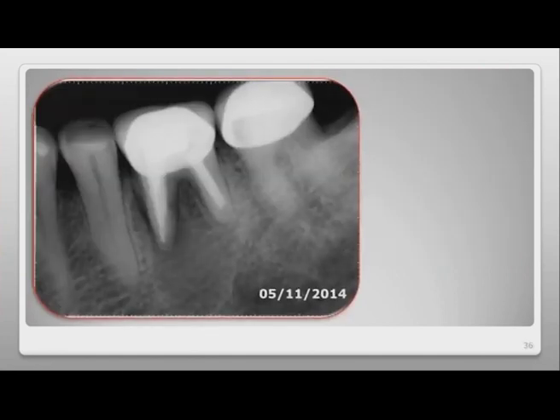The X-ray image shows us the severity of the lesion. I believe it is extremely obvious which type of lesion destroyed the bone that caused the lesion. It is of endodontic origin.